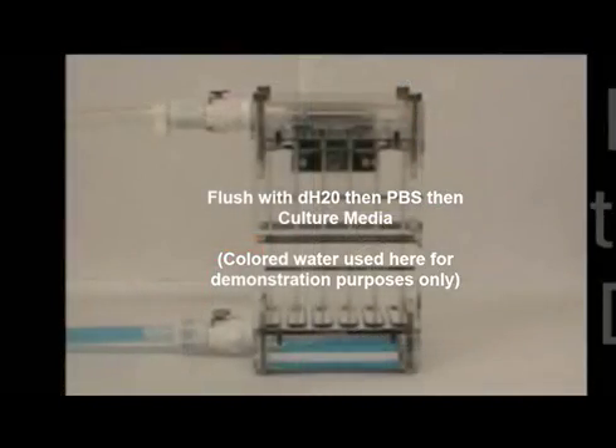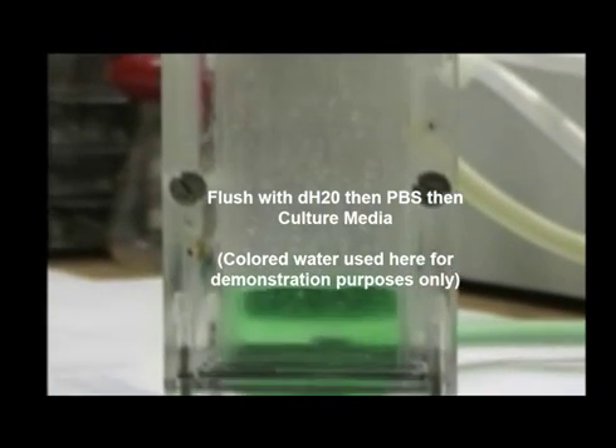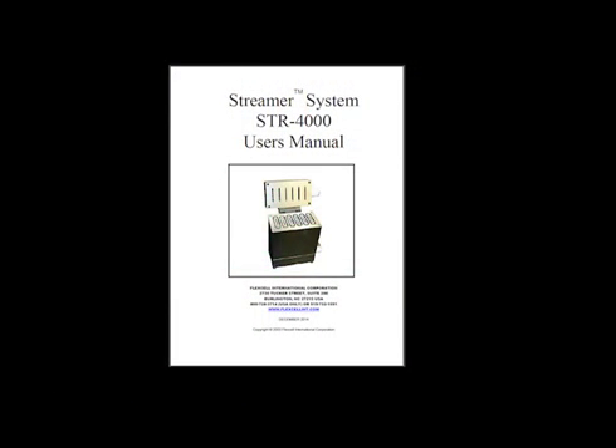Before the first use, run deionized water through the entire system to make sure there are no leaks. Prior to use with cells, please flush the entire system first with PBS and second with tissue culture media. Please see the streamer user manual for proper techniques on handling the slide sterilely and ensuring the system is air bubble-free.